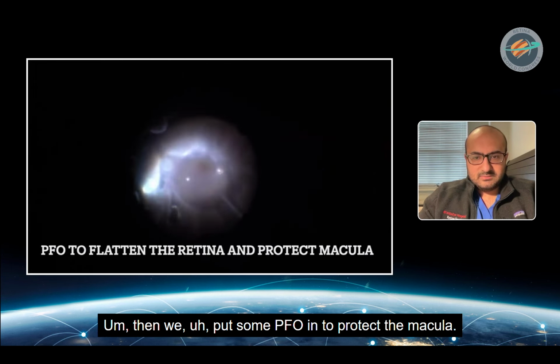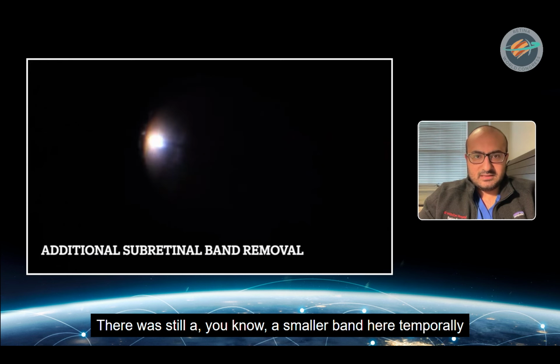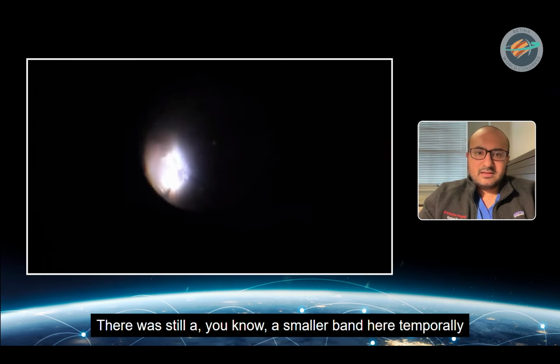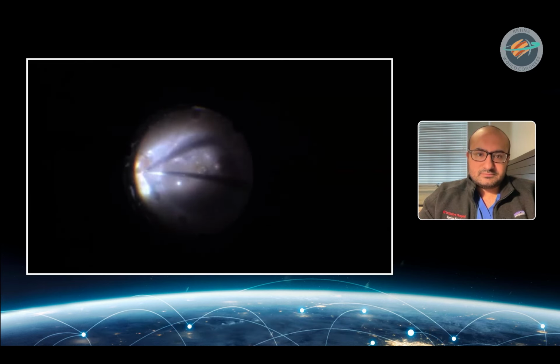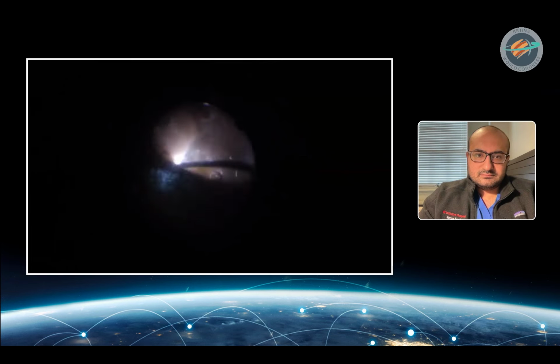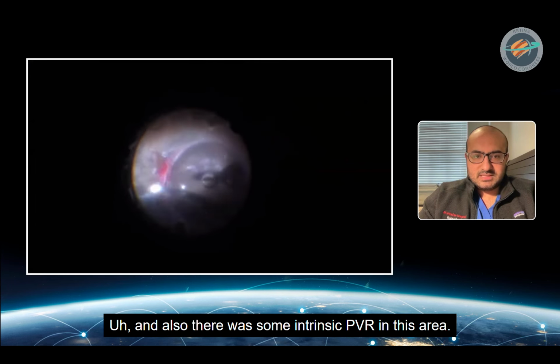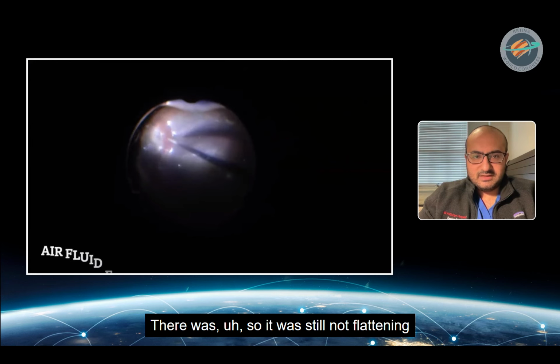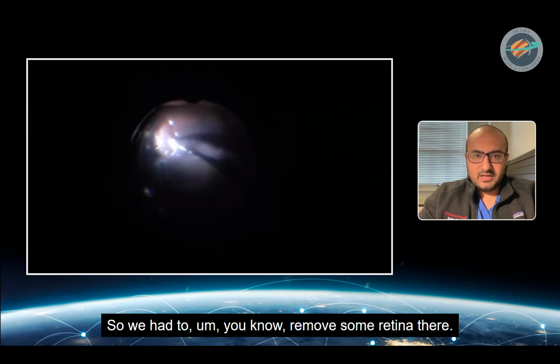Then we put some PFO in to protect the macula. Also, we wanted to see if the retina would flatten. There was still a smaller band here temporally that we decided we needed to remove as well. And also there was some intrinsic PVR in this area. It was still not flattening after we removed that additional band, so we had to remove some retina there.